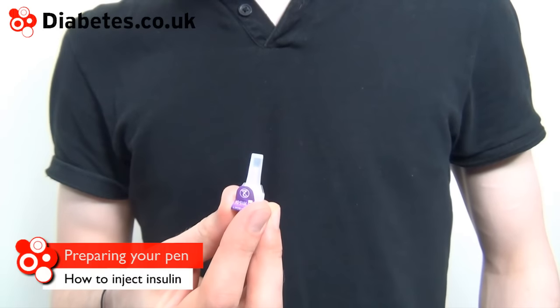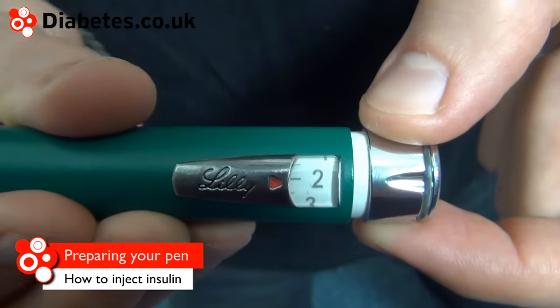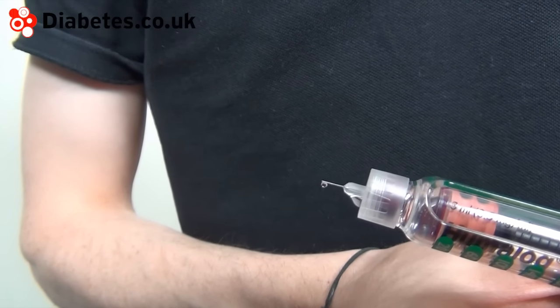To prepare your pen, attach a new needle onto it. Perform an air shot to clear any air out of the needle. You should see a steady, unbroken stream.